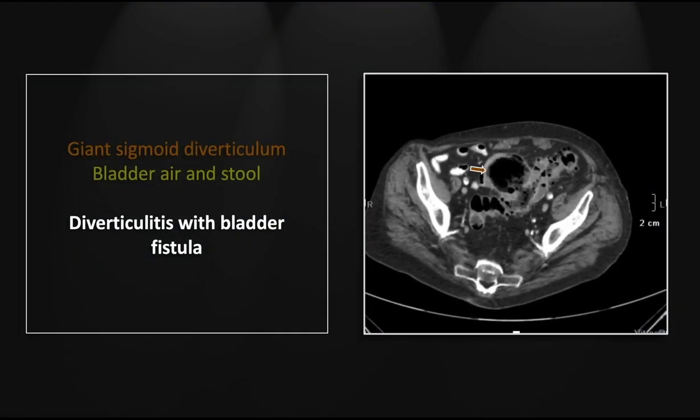There is a giant diverticulum adjacent to the sigmoid colon — a large collection of gas and debris with a heterogeneously thickened wall. Note also there is a defect at its base where it communicates with the lumen of the sigmoid colon. There is otherwise extensive diverticulosis and hypodense wall thickening throughout the sigmoid colon.